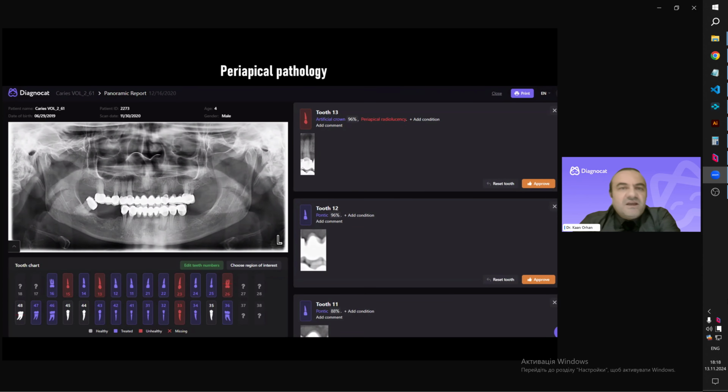All right. The third issue, especially as a dentist, is that we are face to face with periapical pathologies. There are many reasons for periapical pathologies, but diagnosing them is quite important because, especially using 2D imaging, it can be misdiagnosed because of the superimposition and the magnification, and also due to technical limitations.